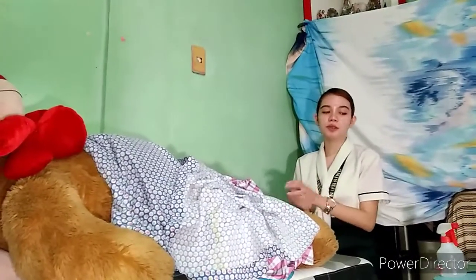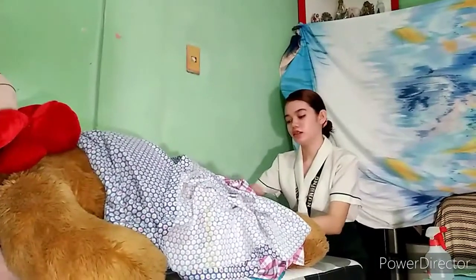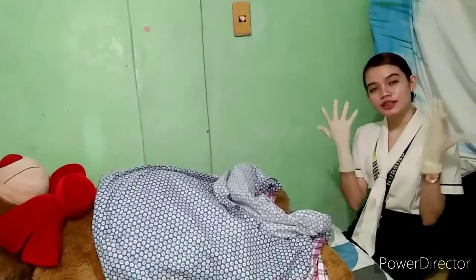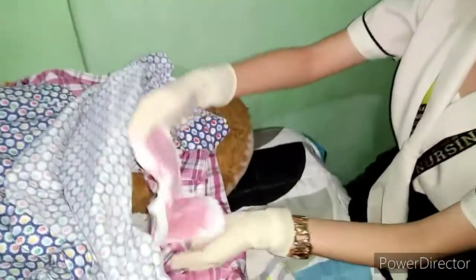Now that I'm done washing my hands, I will apply an alcohol. And then I will put an antiseptic solution to the patient's thighs. Now I just put my sterile gloves. This protects you by preventing any accidental contact of a substance that could carry a microorganism through break in your skin. So we will now be checking how extensive the bleeding of our patient. Okay, it's very extensive.